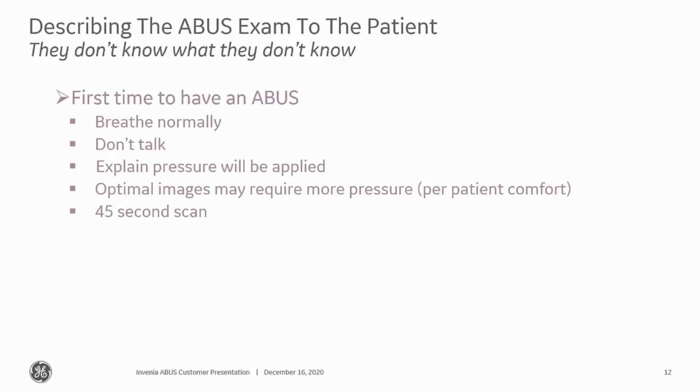And we do tell them not to talk. Of course, they can talk throughout the extent of the exam, but we do emphasize we don't want them to talk during the acquisition part. So I like to explain to them that we're going to be applying some pressure. We keep you in a certain position for all views on the right side, and then we'll do the same for all views on the left.